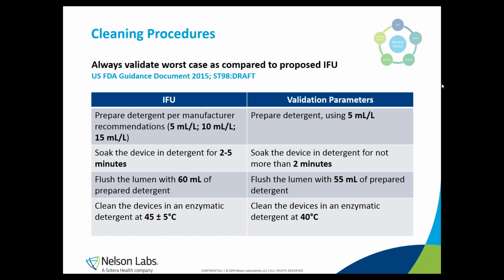By doing so and choosing a worst case scenario, you take a human factor into account during your cleaning procedure, because in a healthcare facility later on, you can imagine that the shortest soaking time, for example, may be chosen by the operator performing your cleaning procedure just to save some time.